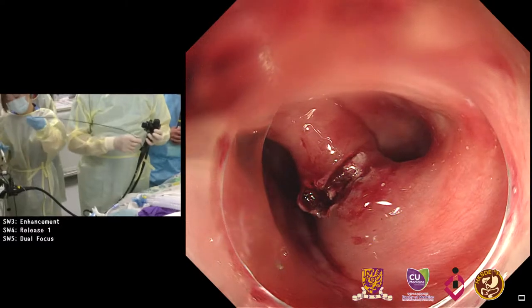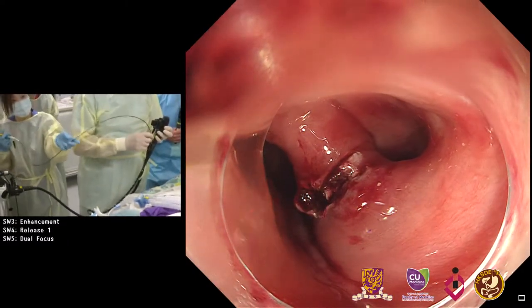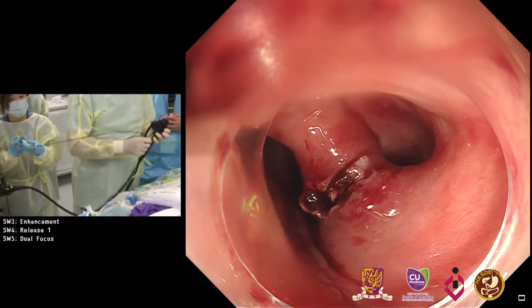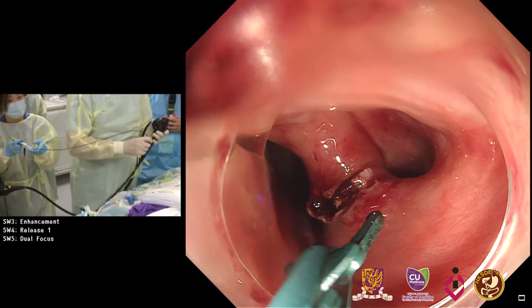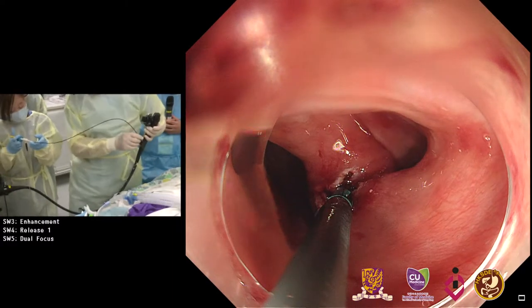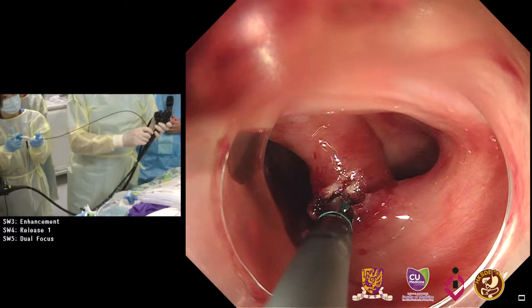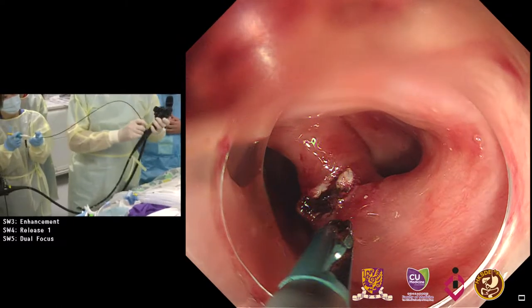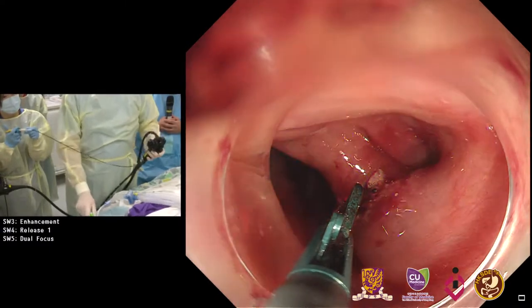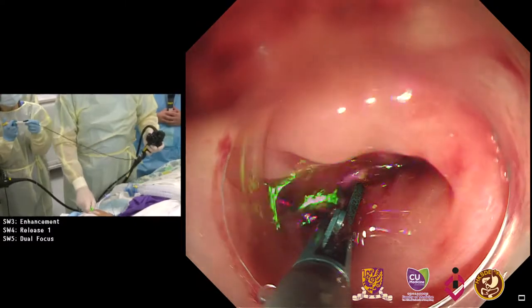This is not perfect for this indication — he needed the long one, which is 7mm in length. In the US we don't have this Cook overtube; it's not FDA approved. A lot of times you'll leave an NG tube in the esophageal lumen just to maintain visualization of that side as opposed to the diverticulum side.